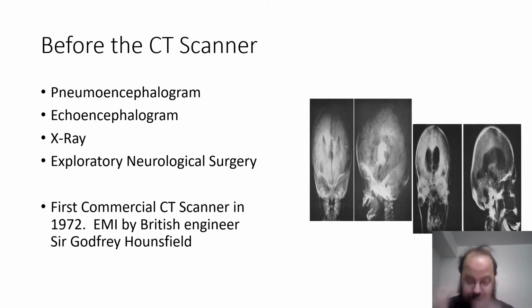They would take compressed air and slowly put it into your cerebrospinal fluid, and then they would literally use a special tilting chair to get that bubble to travel up. Now, fortunately, unlike your circulation, it wouldn't risk causing cardiac arrest or anything like that, but it would cause a wicked headache afterward. And they generally didn't take the air out. You filter through the choroid plexus in your brain, and it would eventually work its way out. However, it did help with the imaging to a degree.